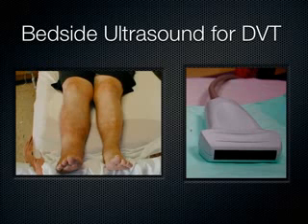And what's the biggest blood vessel in the body? The aorta. It's a deeper structure. You wouldn't want to use this probe on the aorta because you've got to get the sound to penetrate all the way down to the spine, basically, to see the aorta. So that's why I don't really like calling this the vascular probe, because it's got so many uses and you wouldn't want to use it on the biggest blood vessel. So I always call it the linear probe. But just so you know, you might hear someone call this the vascular probe. And it's the one with the highest frequency.